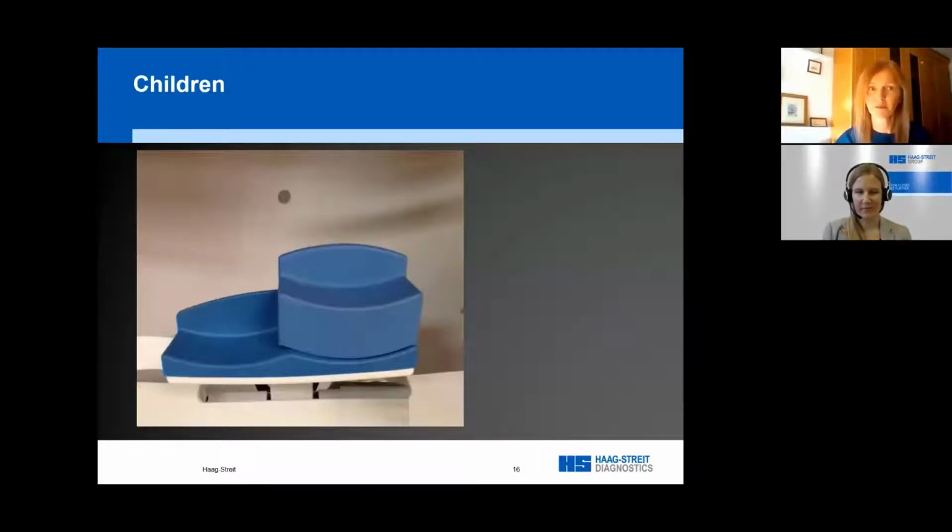They understand games. They understand that in a game you need to respond to targets. So I think it's a case of introducing the test as a game, on their terms and at their level of understanding. My children are 16 and 18 now, but at the ages of 3 and 4 years old, that's when I first introduced them to the Octopus 900 for one of our very early validation studies. Now, acknowledging my parental bias, they had really reliable visual field results. In fact, they were more likely to misbehave during testing because they only see me as mom, but their testing was actually pretty good.